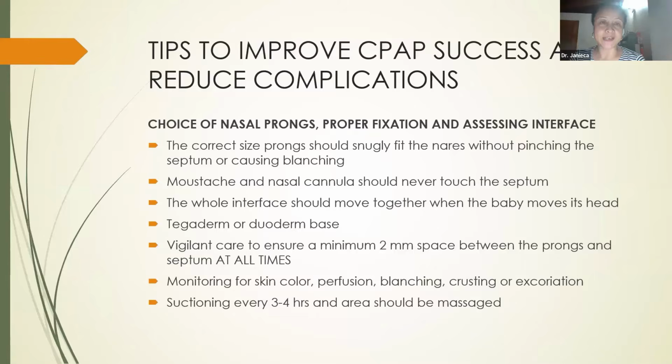We often use a moustache while we are placing the nasal interface. The moustache in the nasal cannula should never touch the septum. When a CPAP interface is fixed properly, the whole interface moves together when the baby moves its head. So we should ensure that the fixation is proper. As we all know, the newborn skin is very sensitive and prone to injury. So in order to protect the newborn skin, a Tegaderm or a Duoderm base may be applied.